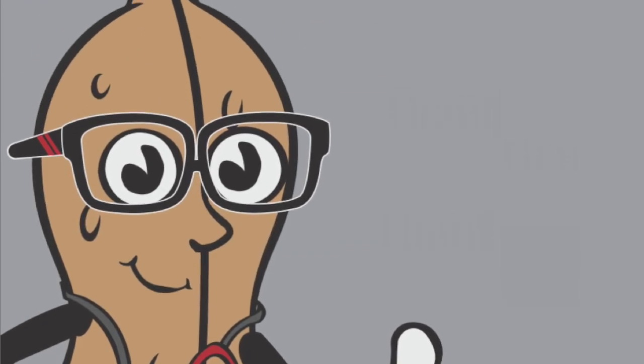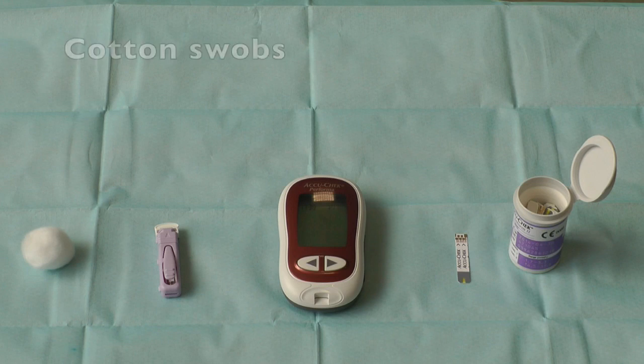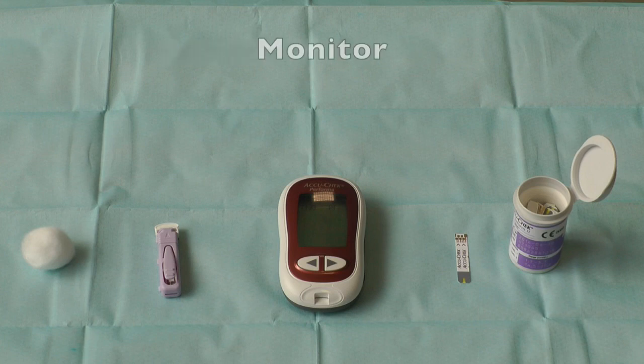To successfully take a capillary blood sample you will need cotton swabs for cleaning and direct pressure, a lancet, and a capillary blood glucose monitor and testing strips.